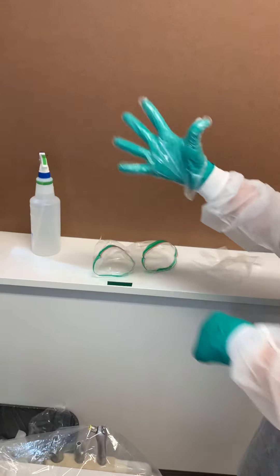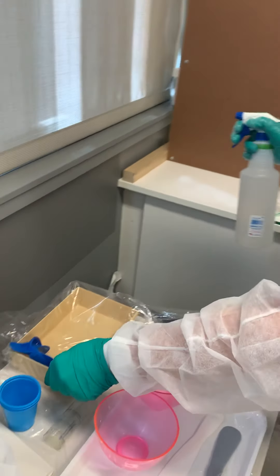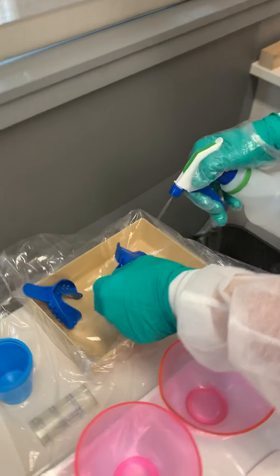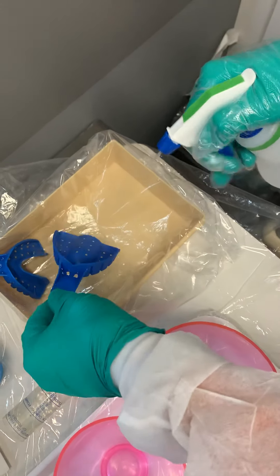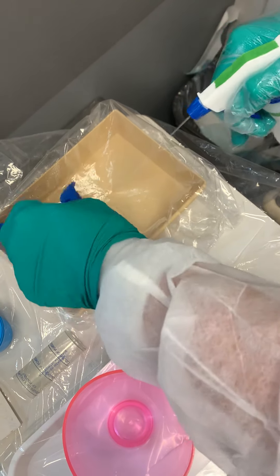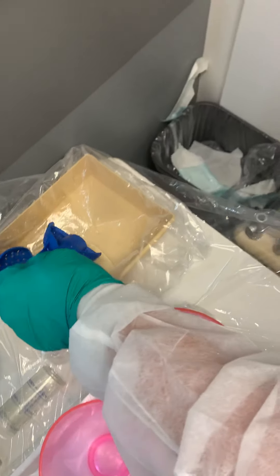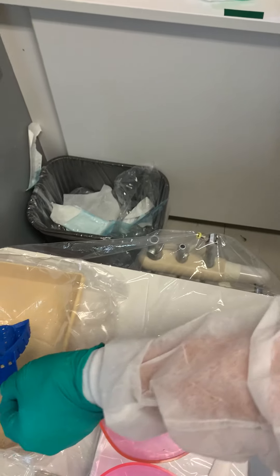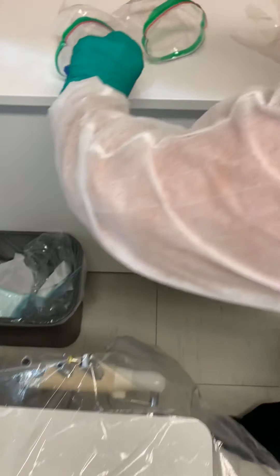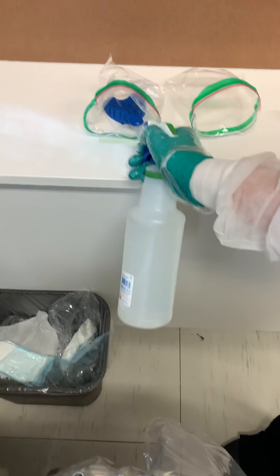Now I have a dirty hand and a clean hand. I'm going to grab with my clean hand, pick up with my dirty hand, and you want to saturate that impression. Really get it down in there and let that disinfectant roll through the teeth. Shake it off, and now we're going to come to our baggie. When you come over, you want to come in and put the impression upside down. Now we need to spray that handle where we touched it.